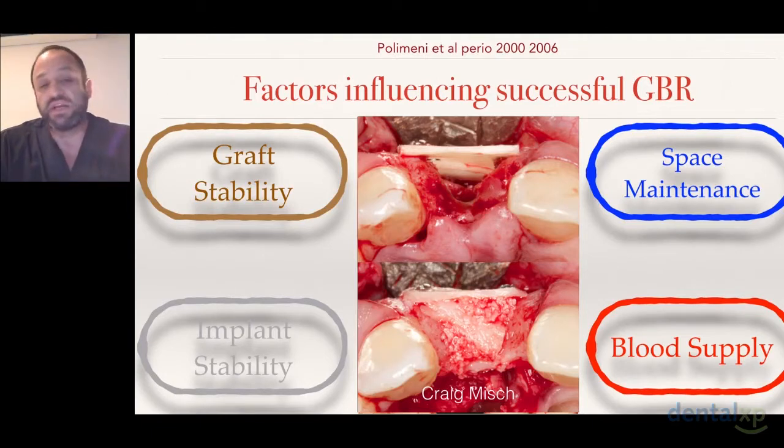It's osteogenic, it's osteoinductive, it's osteoconductive. The conversion rate of the autogenous particles within the bone is very, very quick. Generally within 3 months that is converted if you're using thin plating the way we do, as described by Fouad Khoury in Germany. And really a phenomenal technique.